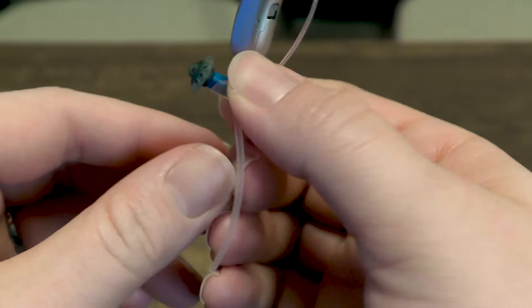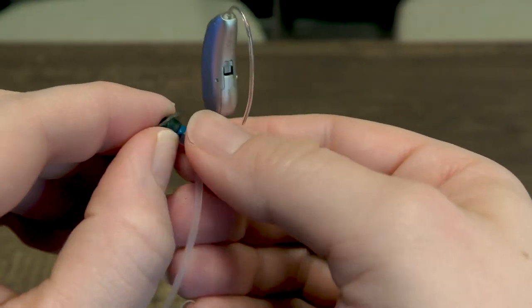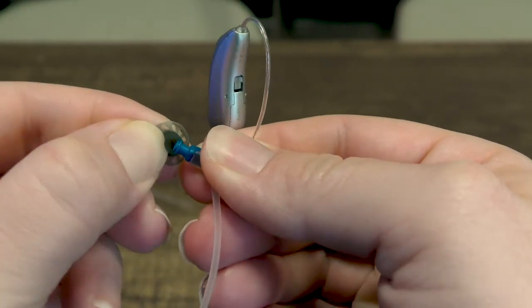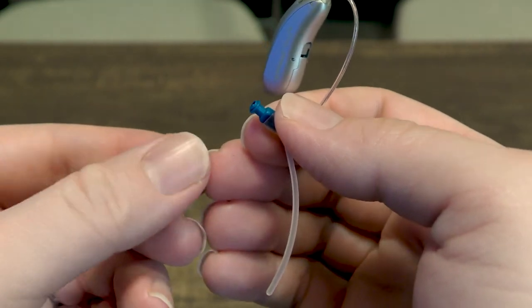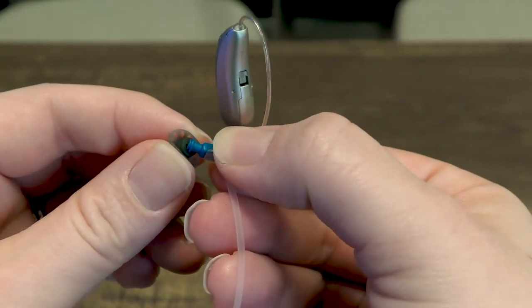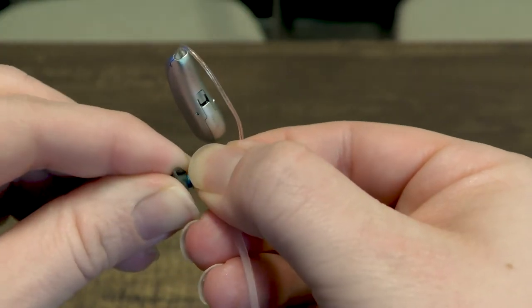I'll show you how to change the domes on the Phonak Marvel hearing aid. So you peel off the domes and then to place the domes back on the speaker you just press it on.